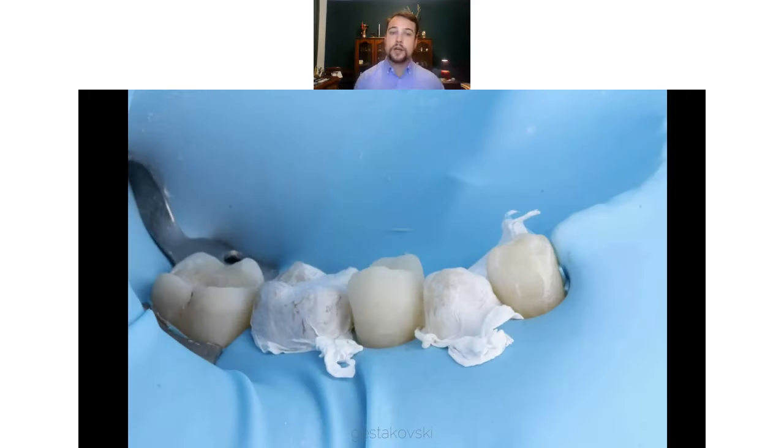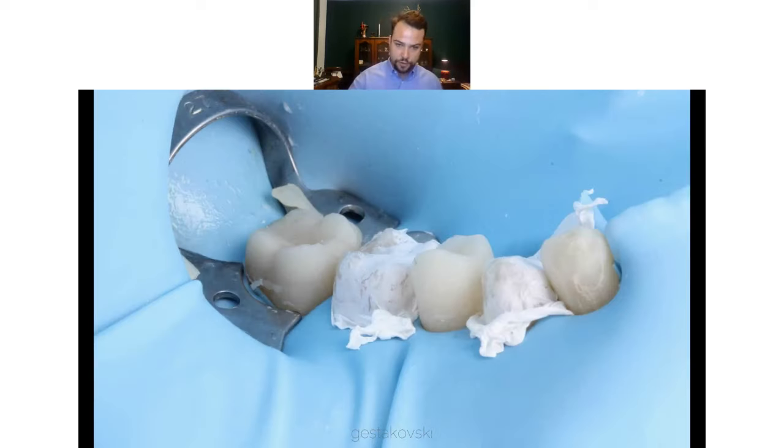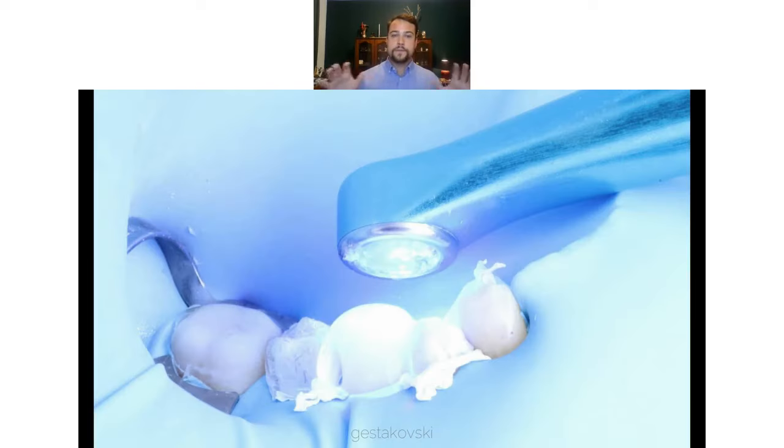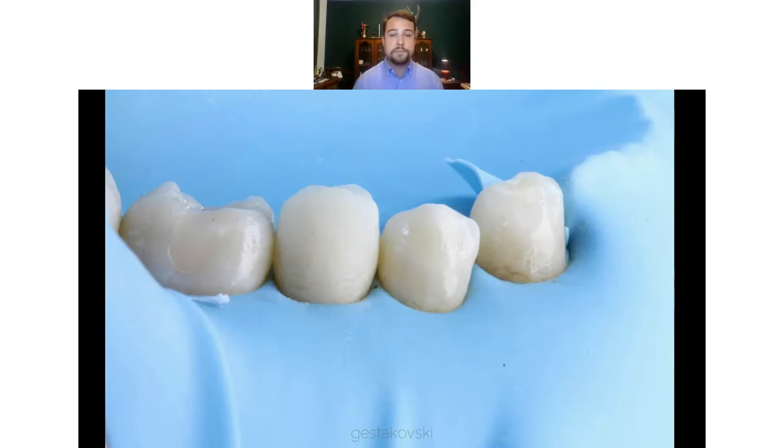Here we did the direct composite tabletop. We raised the occlusal table and later changed the vertical dimension in this patient case. First for one tooth, then for the other tooth, and then for all the other teeth which are planned to be included in the therapy. And if you follow specific rules of the design, you can get this nice shape of your restoration without big excess, without big problems, and so on.